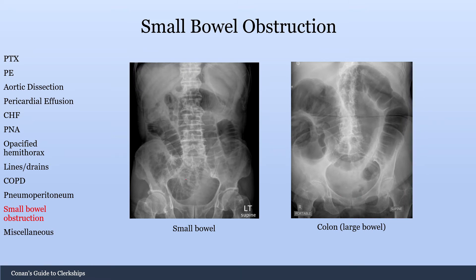Here is another picture showing how to identify small bowel versus large bowel. For small bowel, you'll have the plicae circularis, which go all the way across the bowel, and it should be 3 centimeters. On the other hand, for the large bowel, it's a little bit wider — remember it can go up to 6 centimeters — and here you have haustra, the haustral folds, which do not go all the way across the width of the bowel.